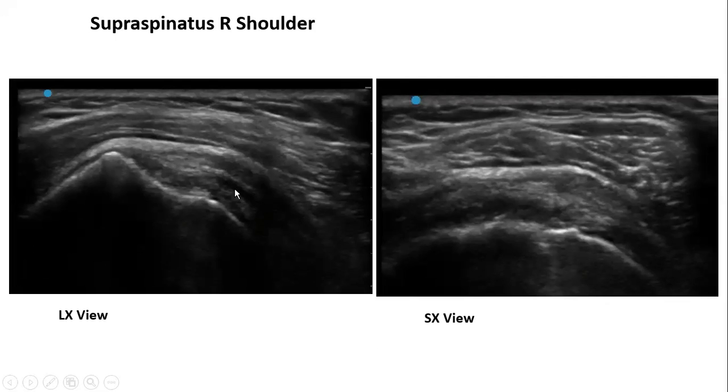So you can see this anechoic area. So there is no tendon here. Then we see some thickening. This can be the capsule, and cartilage is not seen, but it should be somewhere around here. So that should be the cartilage. That's not in focus, but this is some capsular fibers. This is the empty space, and this is bursa. And so is true here. In short axis, you can confirm that no tendon here. That's the bone, and you start to see thickened bursa in this space.